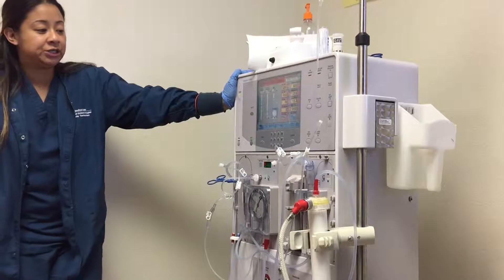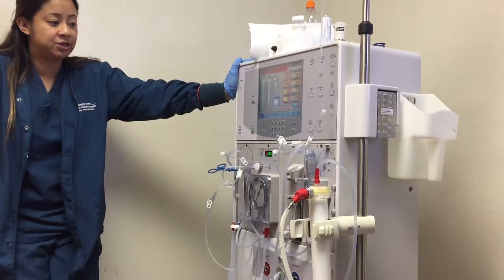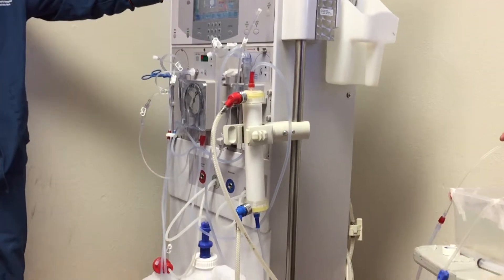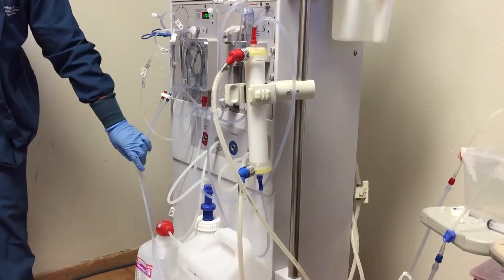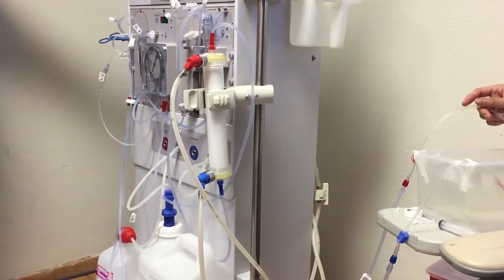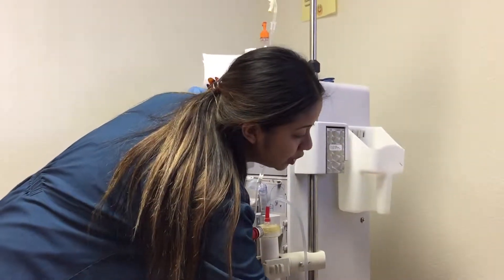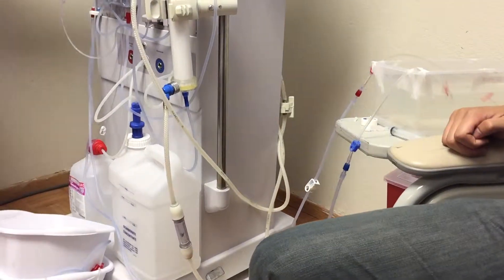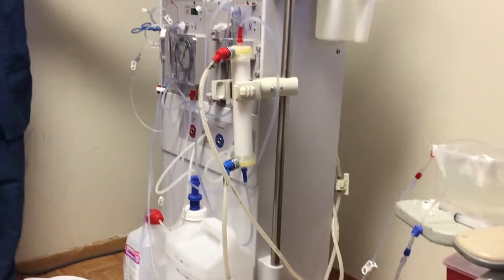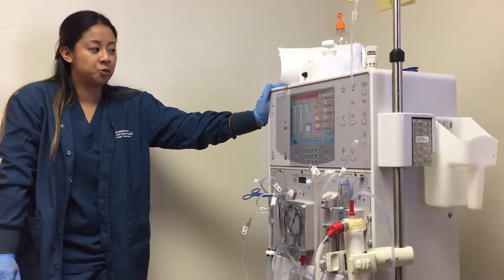One thing you always want to make sure is you keep a really close eye on your arterial line, because there's no air detector that can stop any air. So you just got to keep a really close eye when you're returning. Once you have 300 total, that's when you can clamp your arterial, clamp your venous, and then disconnect the patient. And that's when you do post-sitting, post-standing, and then you can remove the needles.